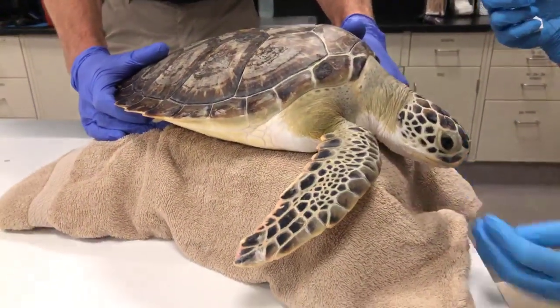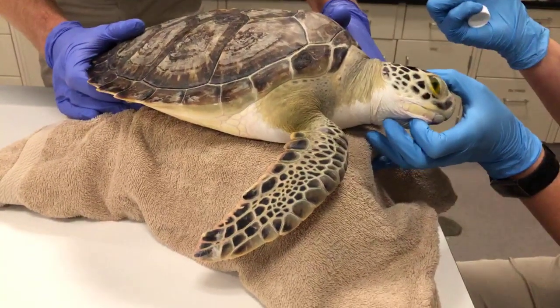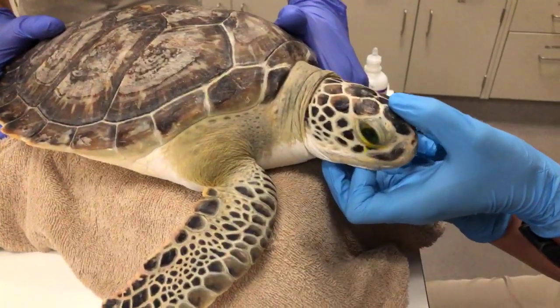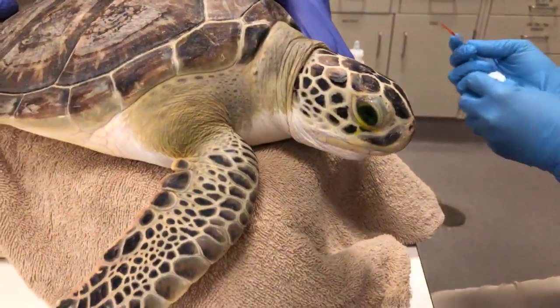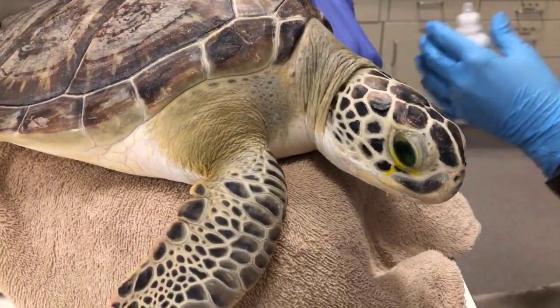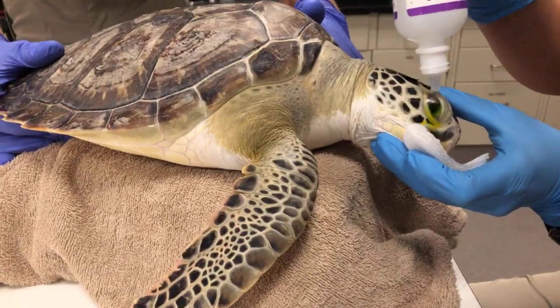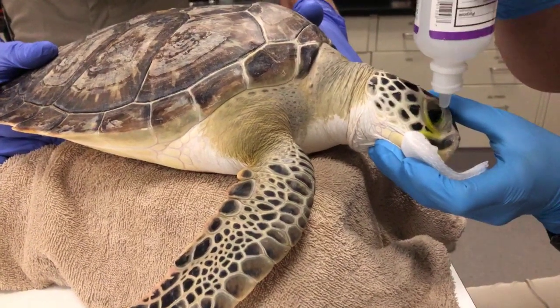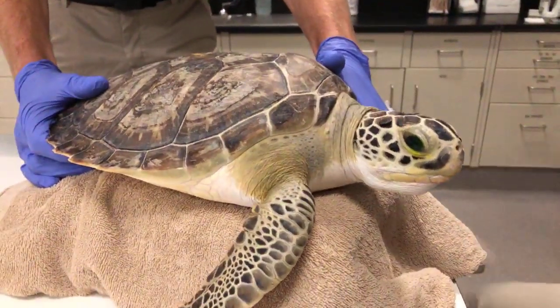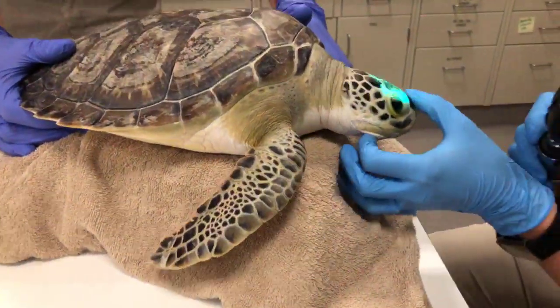What is Dr. Merrow doing right now? Right now, Dr. Merrow is staining the eye, and you can't see a scratch on the cornea with your naked eye. Sometimes they're so small and so faint that you really can't see them. So if you put a little fluorescein stain, which is sort of a glow-in-the-dark stain, and then you flush it out, all the fluorescein should go away if the eye is healthy and there's no tear or ulcer in the cornea. But if there is any kind of compromise to the surface of that cornea, then the fluorescein will stay in. So there'll be a little patch of green or a stripe of green in the eye.